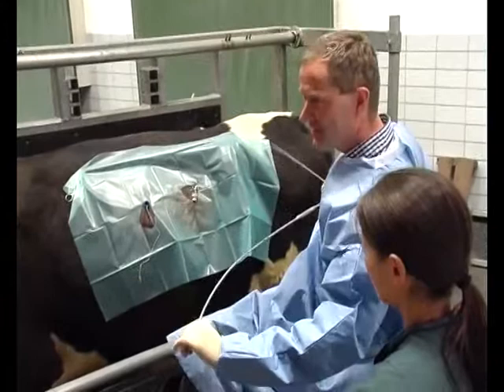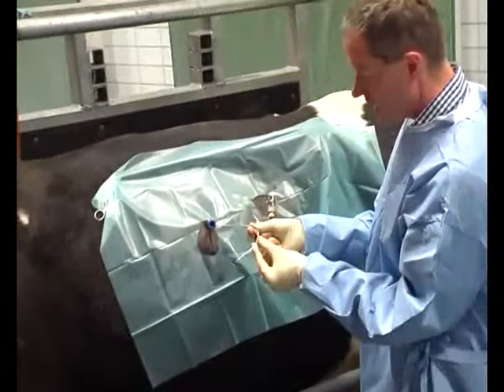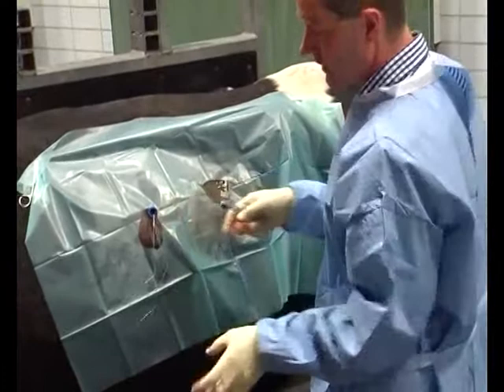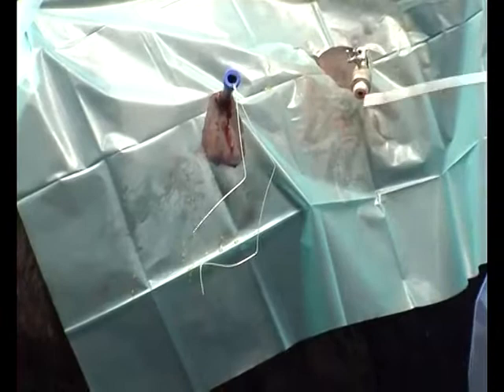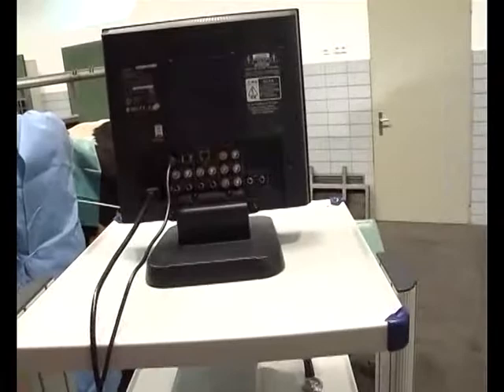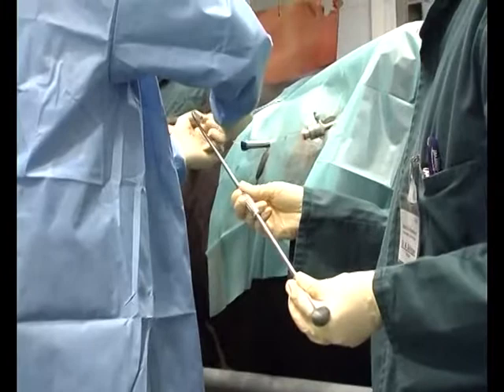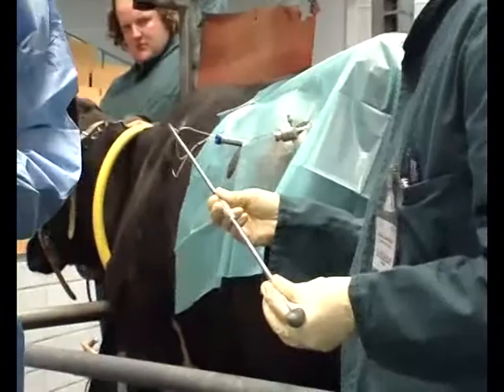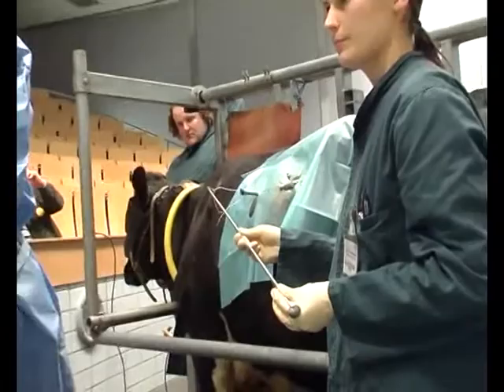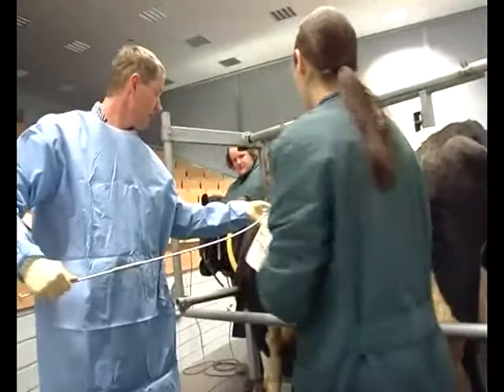So what I can do is do this, make it straight, but I will try to work today with this system. One of the arms you make a little bit shorter, so you are sure the knot is not at the tip of the applicator. If you can hold the applicator, please. Okay, you fix the toggle wire at the top. That's right. The alcoholic, please, again. And also here, I'll take this. Also the wire in the top. And you go down. Very good.